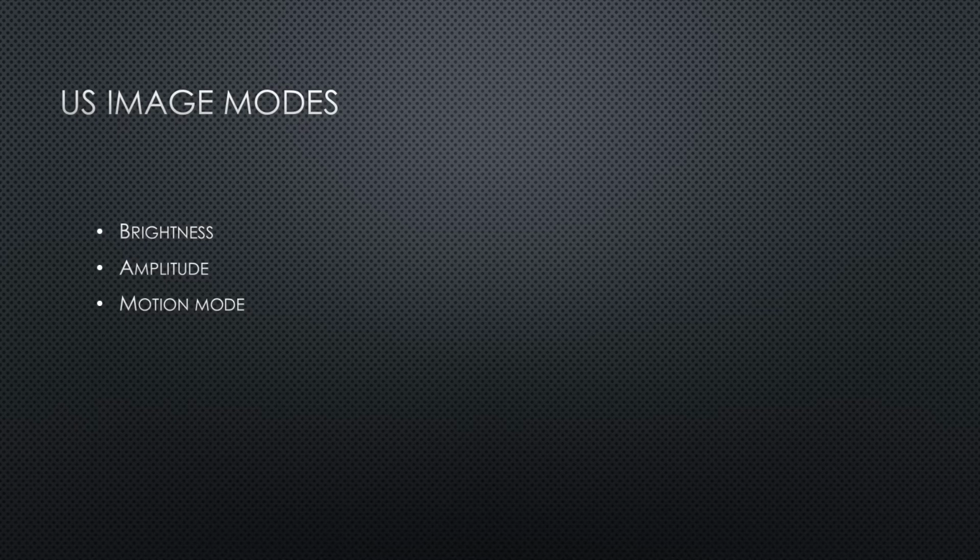Some machines are also equipped with a retrospective M mode called anatomic M mode. We're not going to go into that because, in my experience, it's a GE specific thing, but it is a really useful tool. And if you have anatomic M mode available, I advise that you play around with it and get some experience with it. It's very useful.